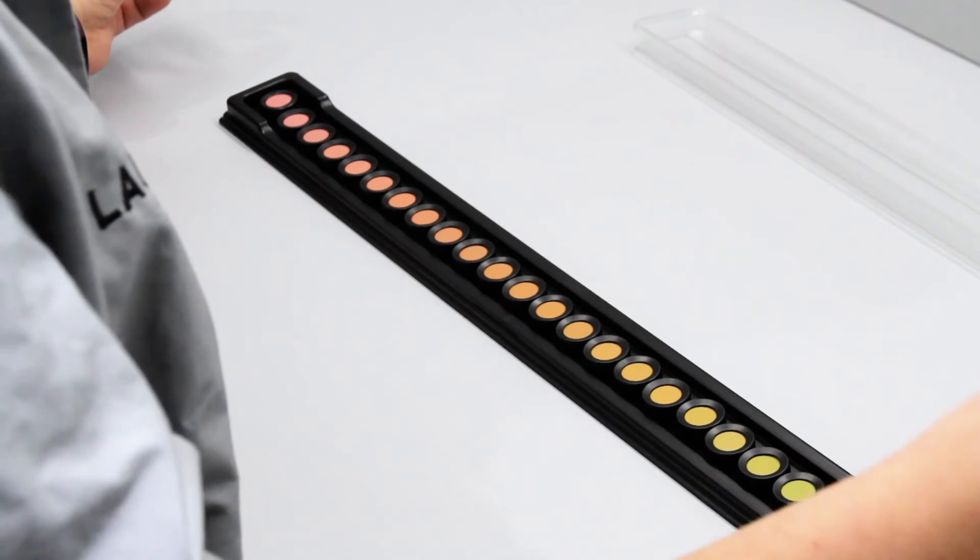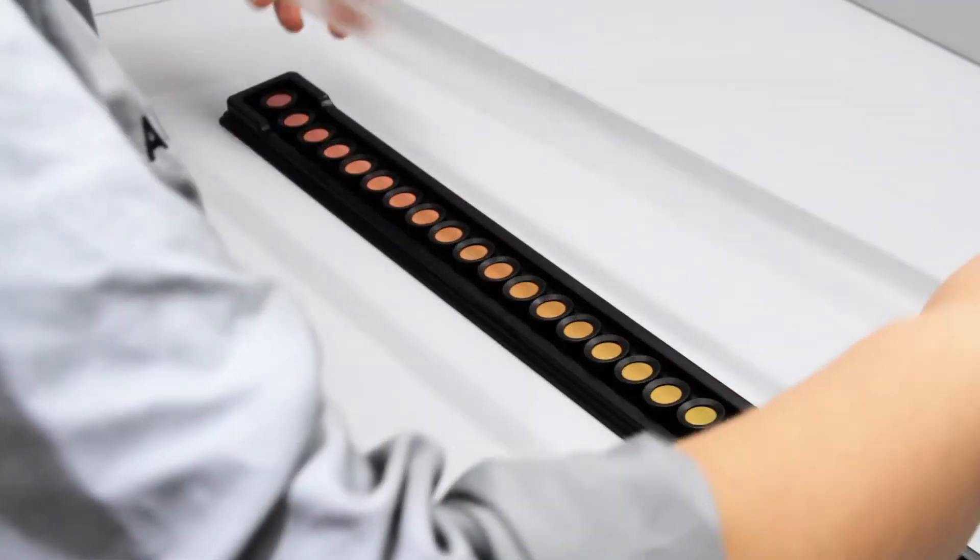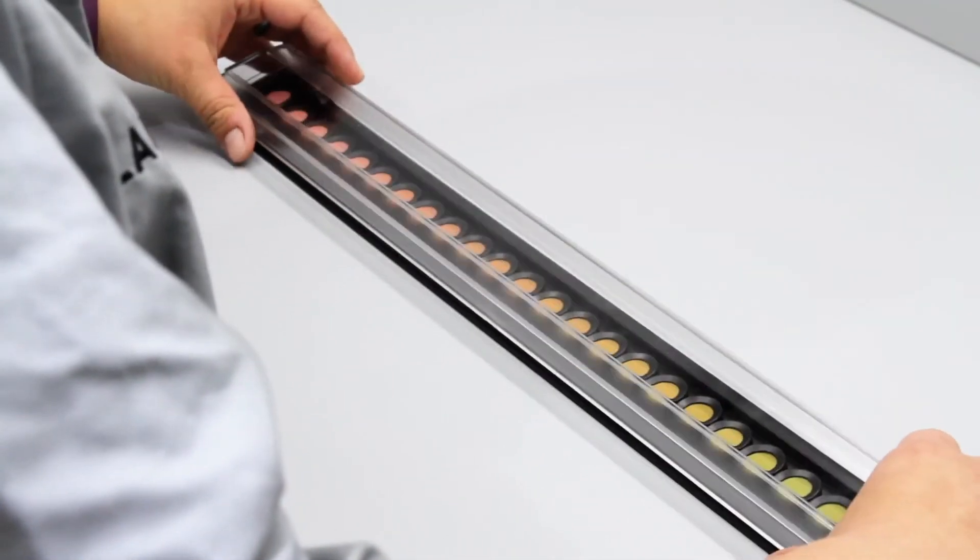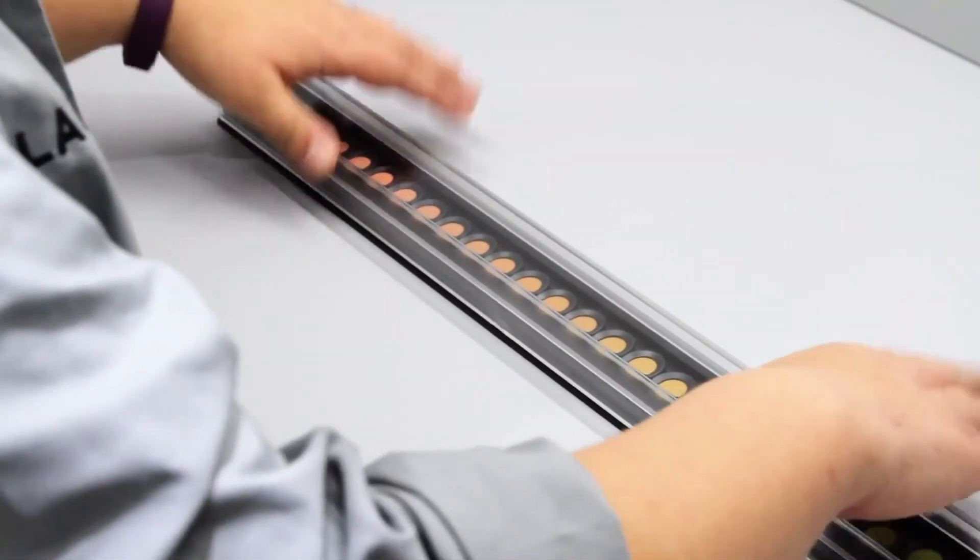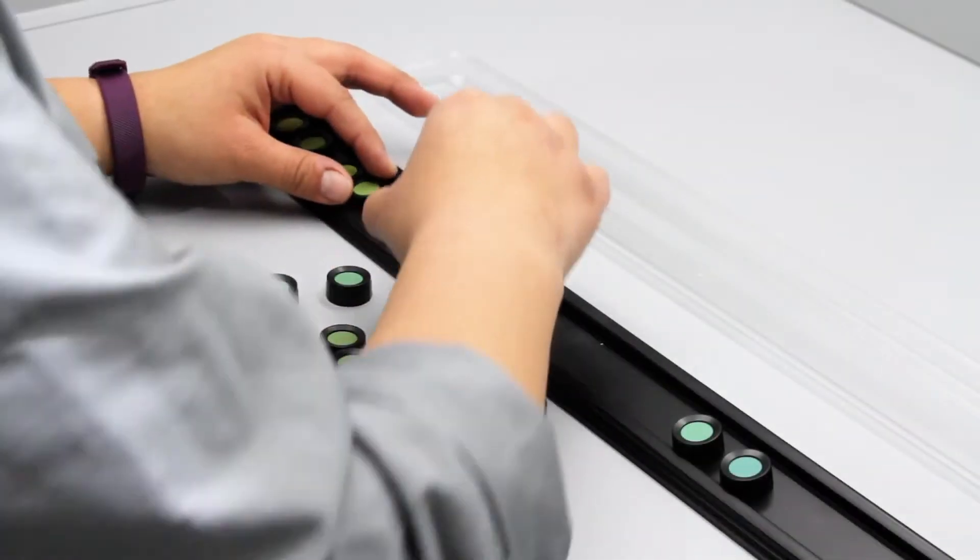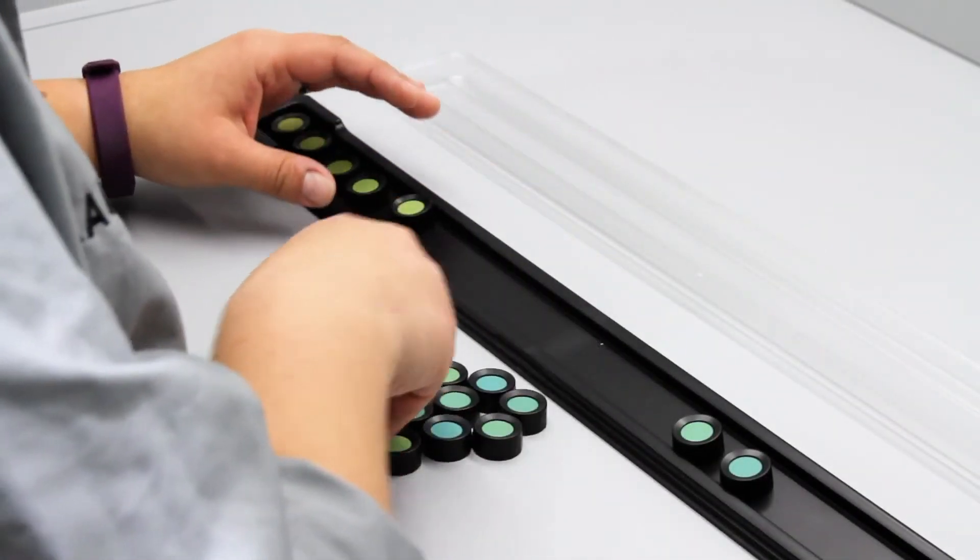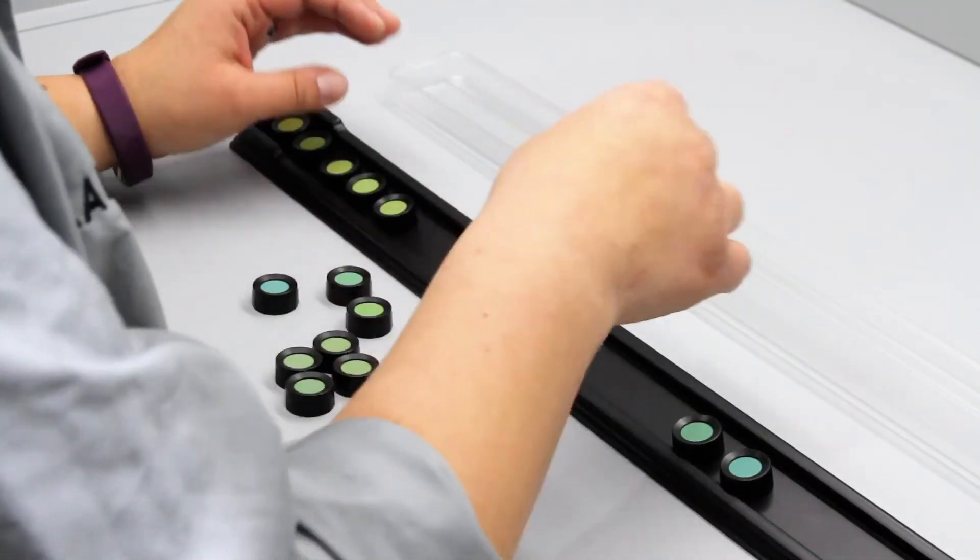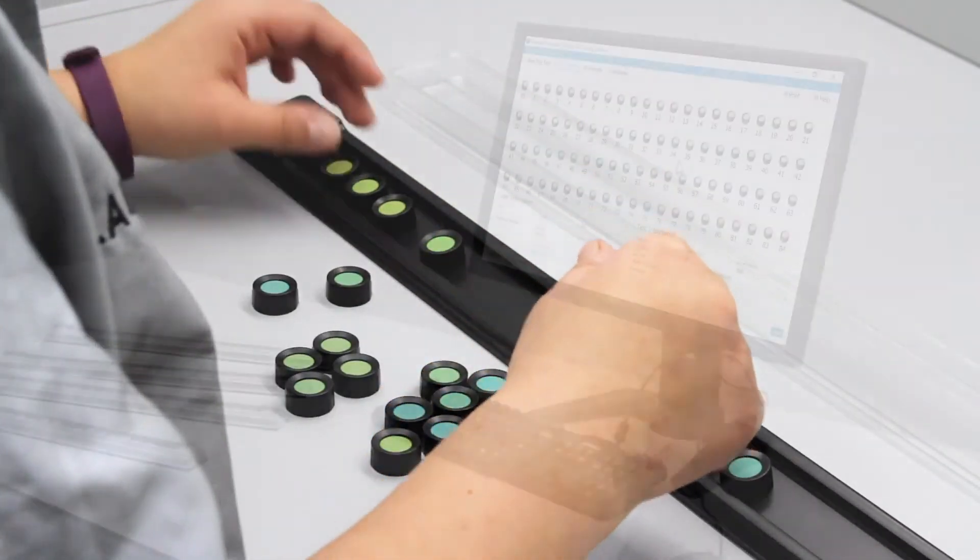Once the first tray is completed, place the cover on the tray. Provide the next tray to the individual taking the test. Continue this process until all four trays are completed.